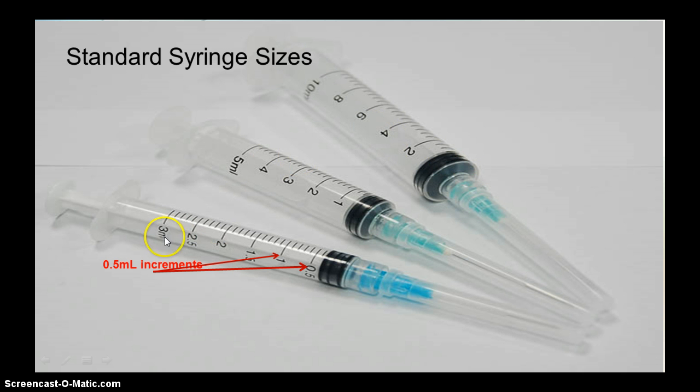Standard size syringes, there's 1 mil syringes. You don't see used too often for IM injections, but there's 3 mils, 5 mils, and this is here for show purposes only. You would never use a 10 mil syringe for an IM injection. It just doesn't happen. Plus, you would never give that amount of fluid.